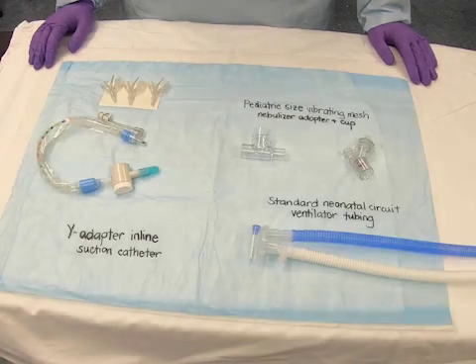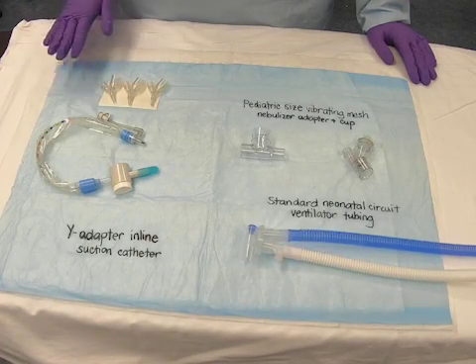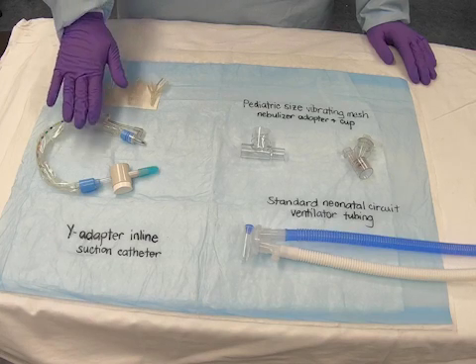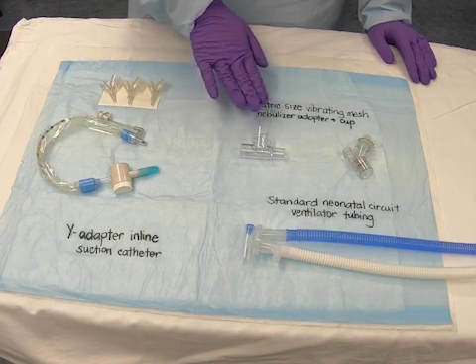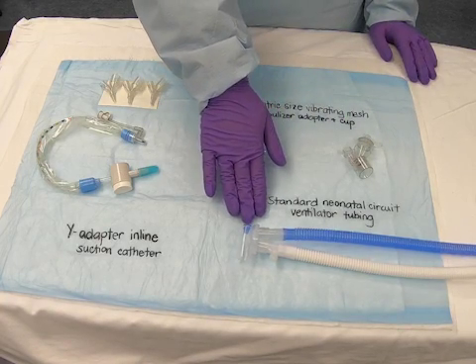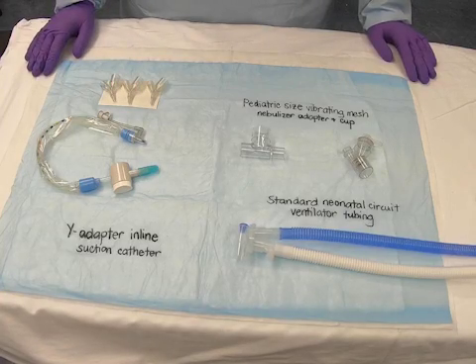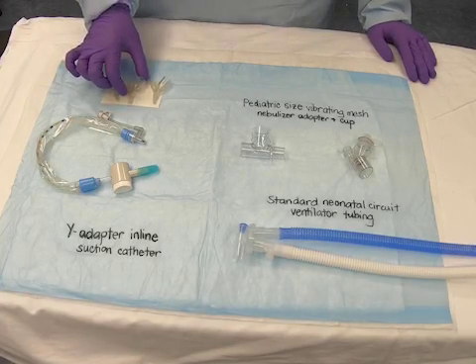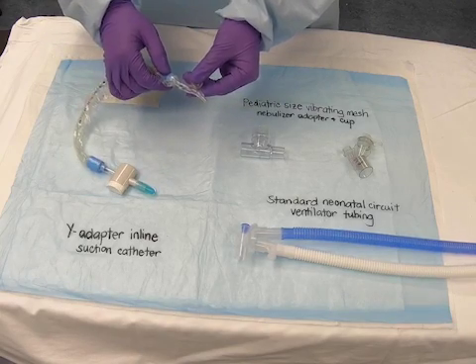To assemble the closed suction ventilator system, you will need one appropriately sized Y-adapter inline suction catheter, one pediatric vibrating mesh nebulizer adapter and cup, and one standard neonatal ventilator tubing which includes a bacterial viral filter. Pick the appropriate sized Y-adapter and connect the suction tubing to the Y-adapter.